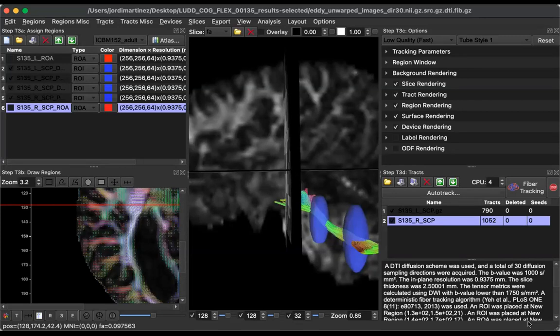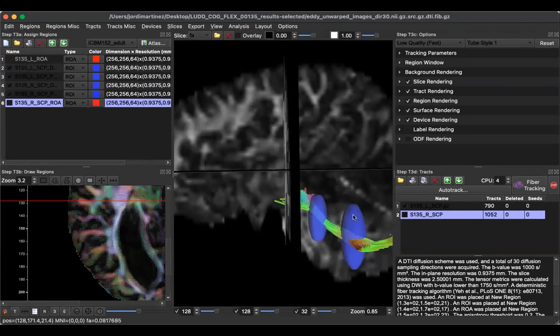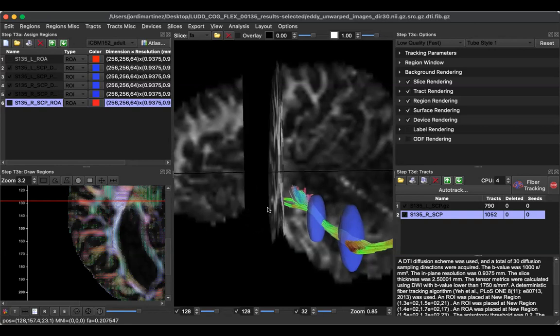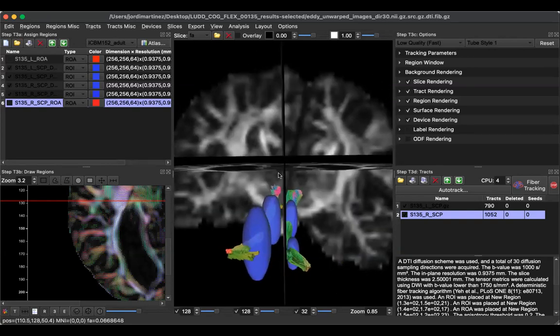Is there more crossing there, right? I don't know if they necessarily have more. So this is basically what I was talking about with the ROIs: when you put a spherical ROI down, it becomes this oval shape. So you have to be very careful with how you place it because it will extend farther than what you want in the height direction. When doing the cingulum and you see that the structural image is shifted, it's difficult because then it extends past and grabs other fibers. So it's hard to isolate the exact track you want. But I'm getting there. I just need to clean up the ROIs and stuff like that. Yeah, the ROIs are really effective for that.